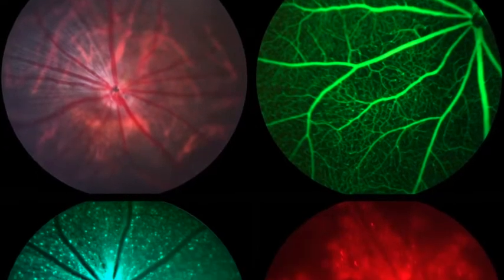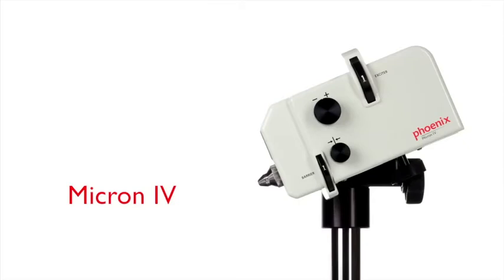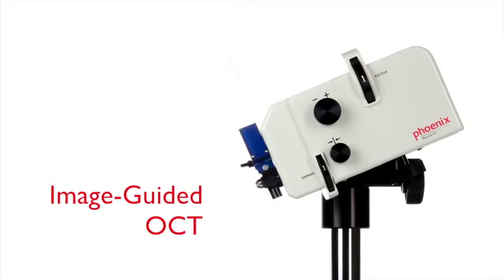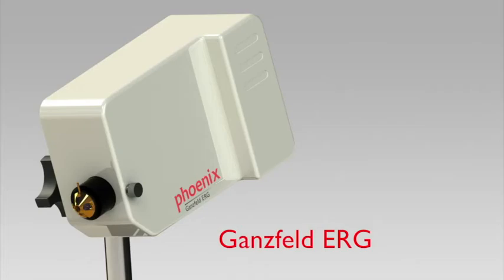Take a look at how the Micron 4 is the host to an ecosystem of image-guided products designed to fuel scientific discoveries in small animal research: the image-guided focal ERG, the image-guided OCT, the image-guided 532 laser, the anterior segment slit lamp imaging system, and the Ganzfeld ERG.